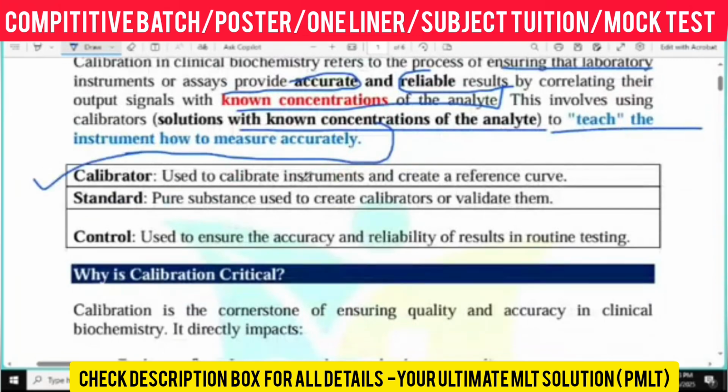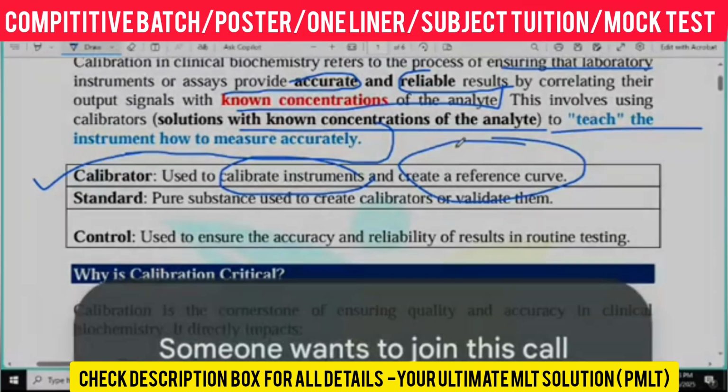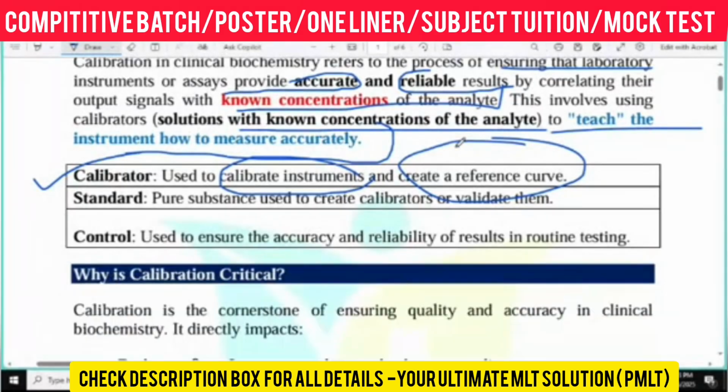A calibrator is what we use to calibrate the instrument and create a reference curve. So the calibrator is used to calibrate the instrument properly and create a reference curve, so that we can easily measure the right result and the normal ranges.